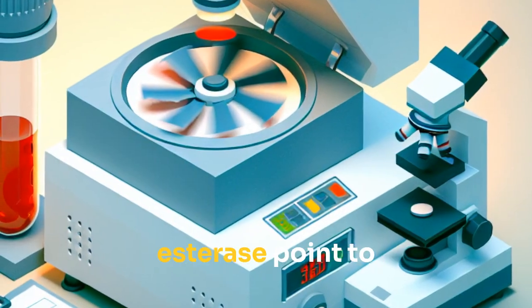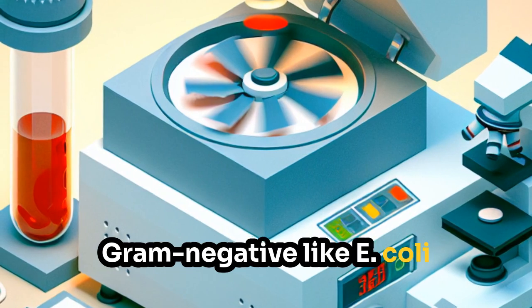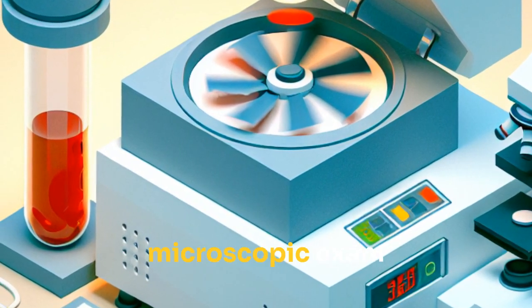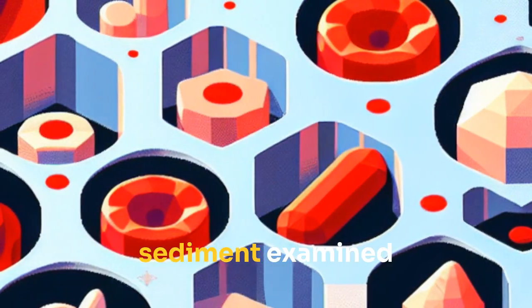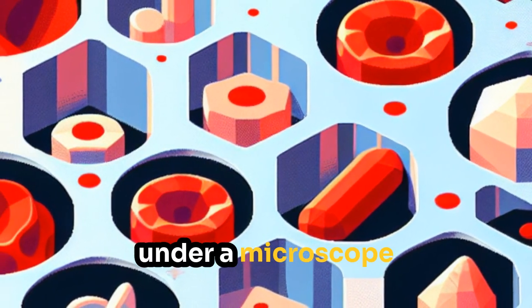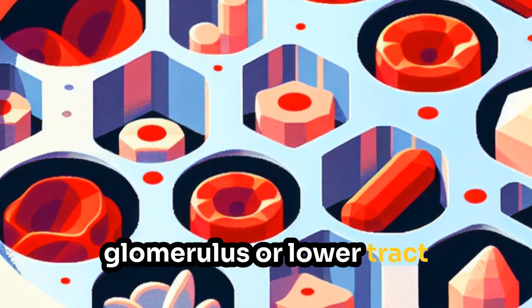Nitrites and leukocyte esterase point to bacterial UTI, especially gram-negative like E. coli. Third, the microscopic exam. Urine is spun in a centrifuge, and the sediment examined under a microscope. Cells: red blood cells could come from the glomerulus or lower tract.